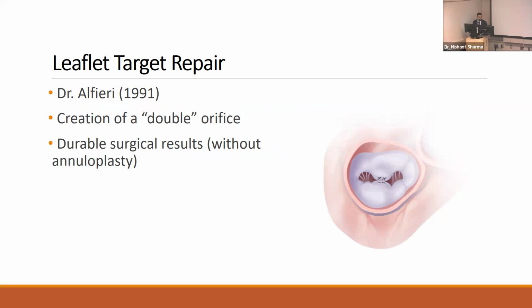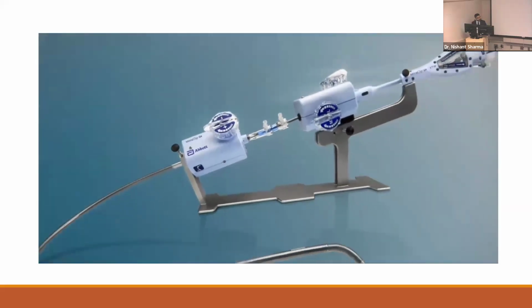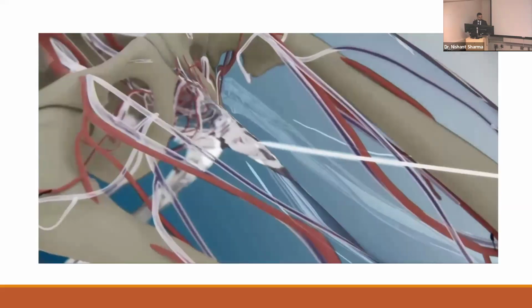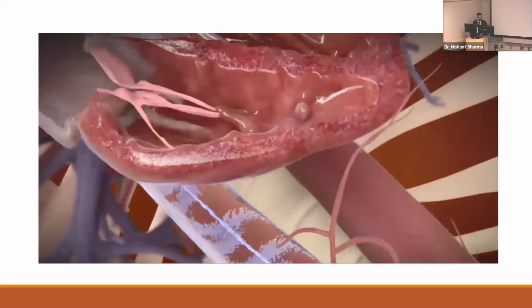He showed that there were very durable surgical results long-term, and that even extended out to patients that didn't get an annuloplasty. So this video that's playing is just a brief overview of the device. It is a transvenous access with a 22 French sheath.